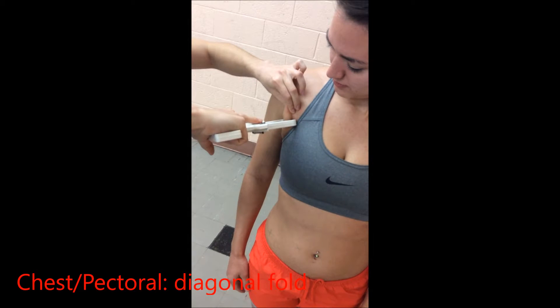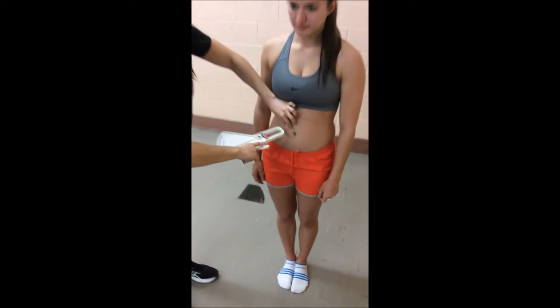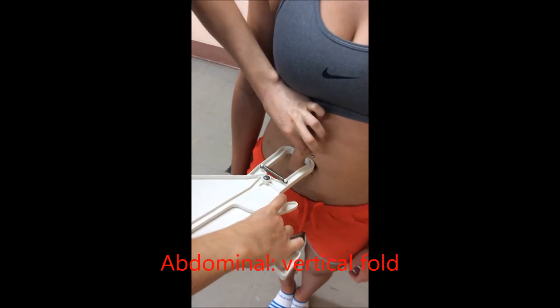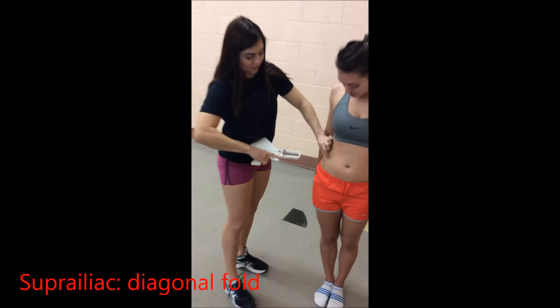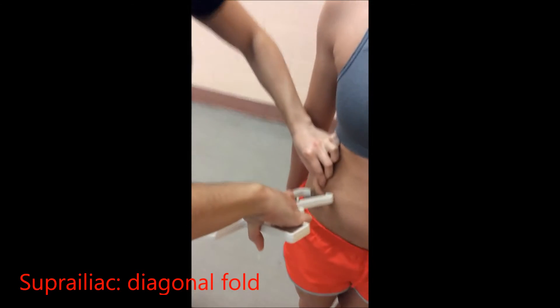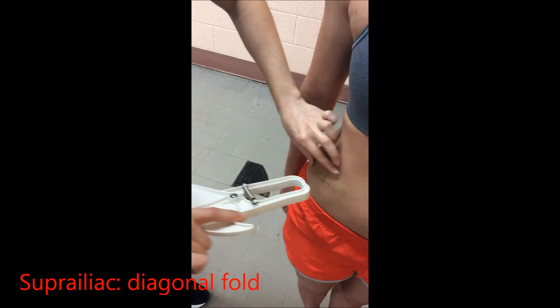Hold the caliper in your right hand with the dial facing up. Place the jaws of the calipers perpendicular to the fold, 1 cm below the fingers and halfway between the crest and base of the fold, and release all pressure on the scissor grip while keeping the caliper perpendicular to the skin fold.